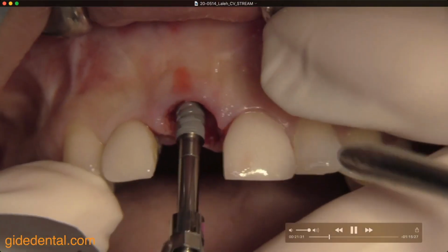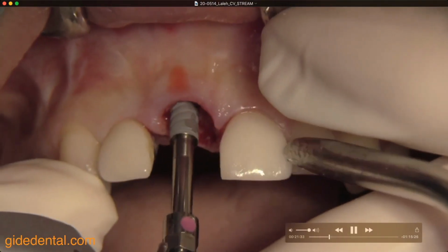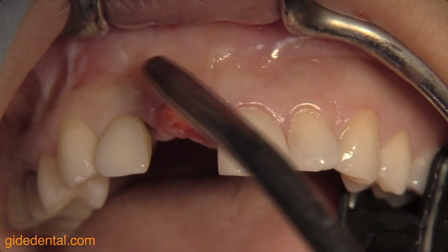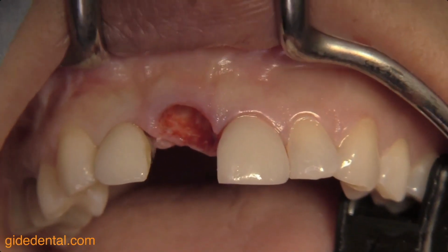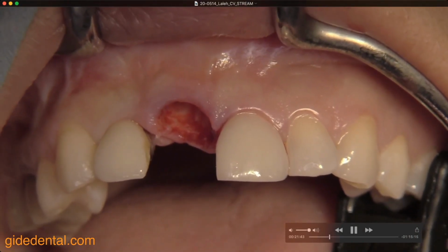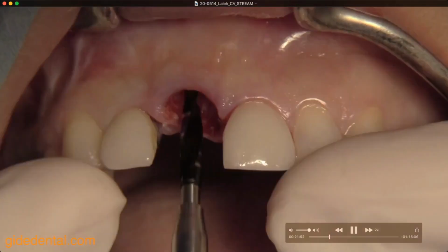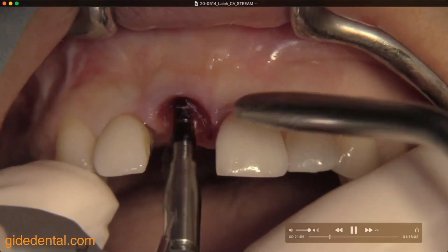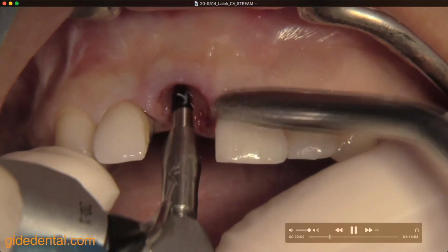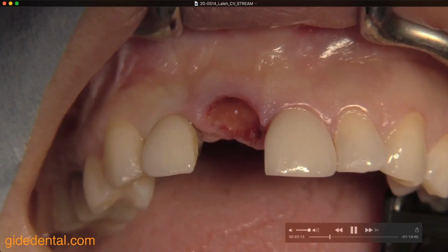So here's the implant, and I'm actively guiding it with my hand, and I'm having a little bit of trouble here, as you can see, feeling comfortable with placement. And I'm coming, there's something which I don't like in the internal part, which probably is like the amount of implant that I can move in here.